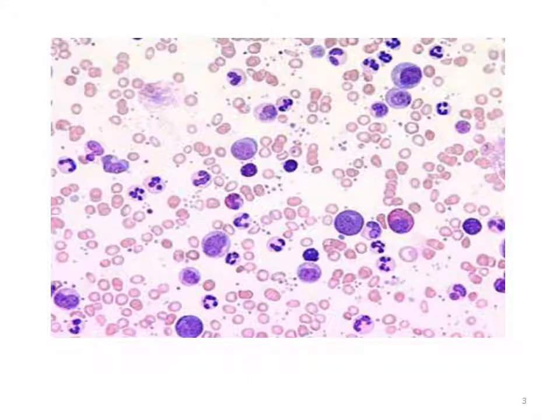The peripheral blood smear is an important laboratory test to help healthcare practitioners in the assessment, diagnosis, treatment, and monitoring of patients. Manual differentials encompass counting and delineating white blood cells, morphology of red blood cells, and a platelet estimate.